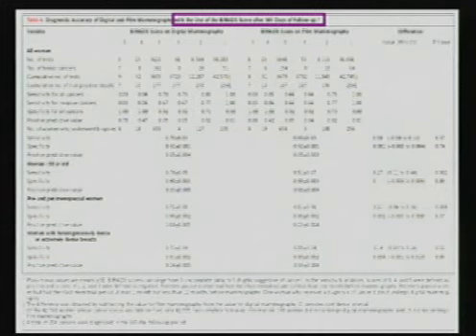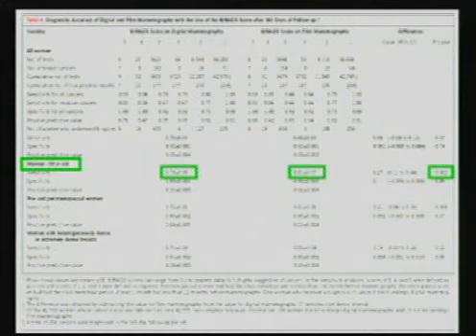And so when we look at this now, we'll see that all women, in terms of the sensitivity and specificity of the exam using 1-year interval and BI-RADS data, show a sensitivity of digital of 70% and film screen of 66%. Again, they were not statistically significantly different, but this is much more in line with what we would expect as the performance of mammography. How about these subgroups of women? In women less than 50 years old, there was an enormous difference with a p-value of 0.002 in the performance of the two modalities. This is hugely statistically significant.